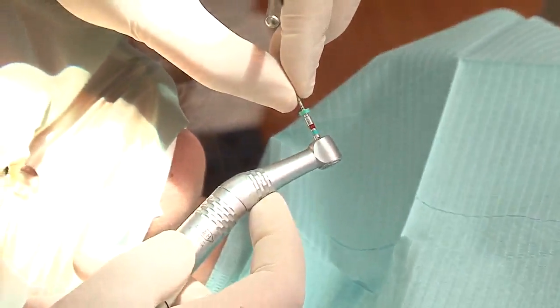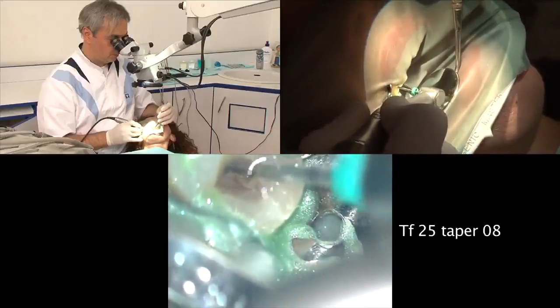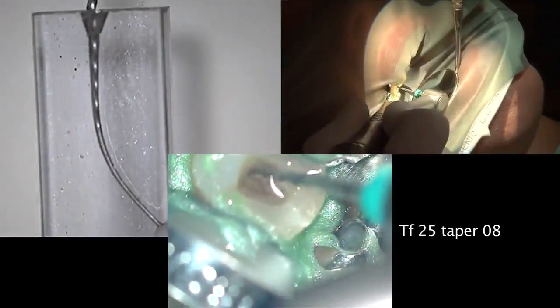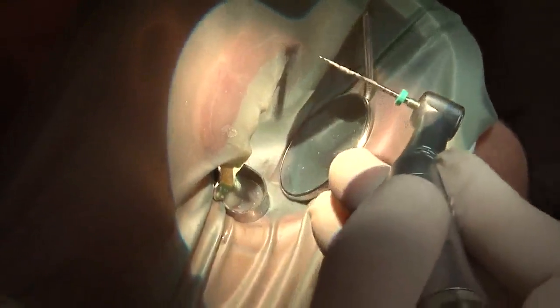We start the crown-down technique using TF5s 25-taper8 and 25-taper6. We never insert the file and lock it inside the root canal, and we never rotate the file outside the root canal. What we need to do is insert the file until we have contact, go back one or two millimeters, rotate, and do a four-stroke movement with 500 to 600 RPMs — torque level set to maximum. Four strokes as deep as it goes in the buccal canal.